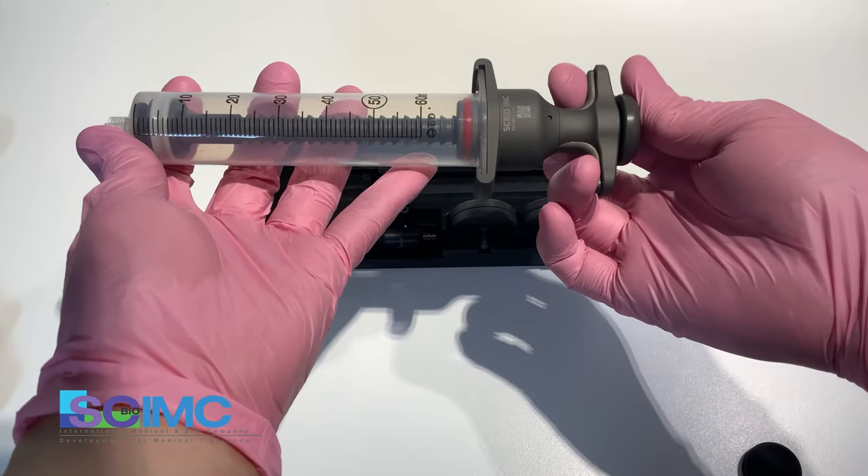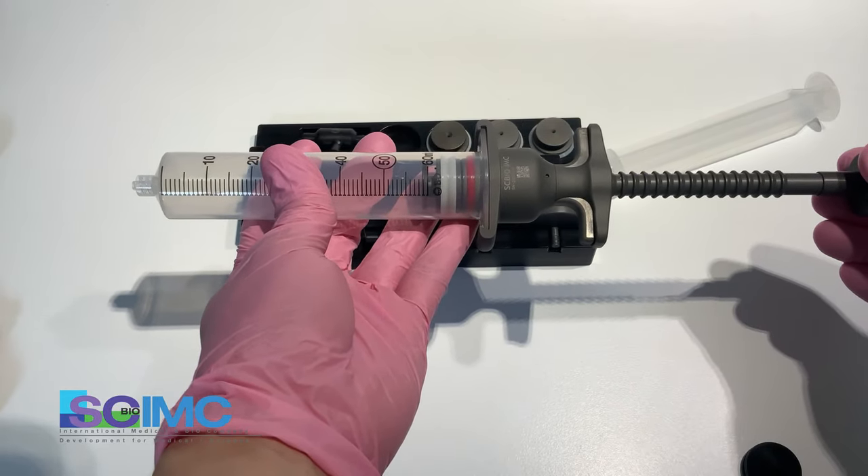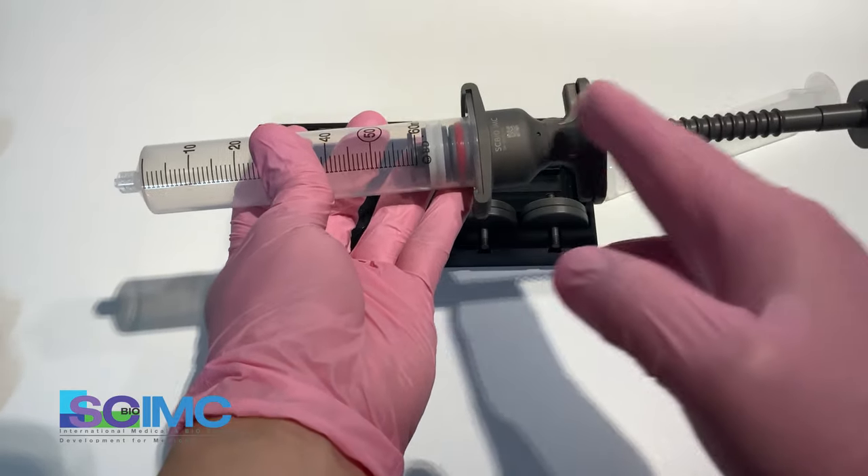This button — when you touch this button, the locking system is released. When you pull the plunger, the locking system locks the plunger.